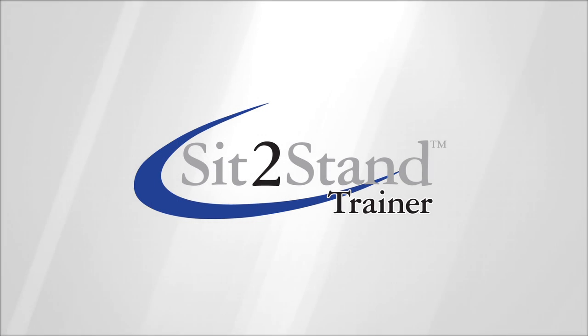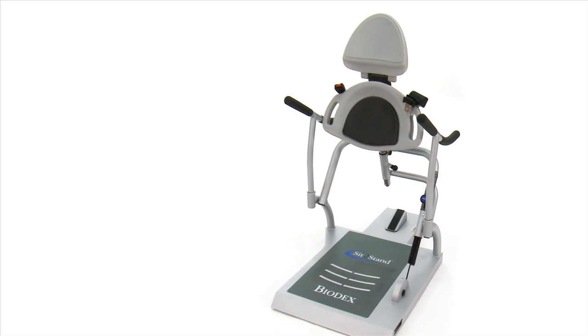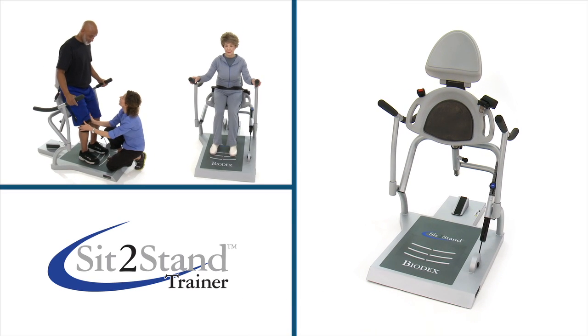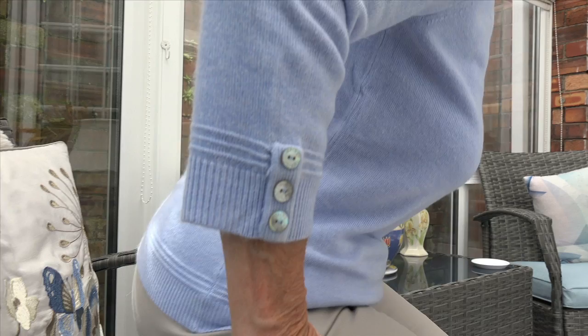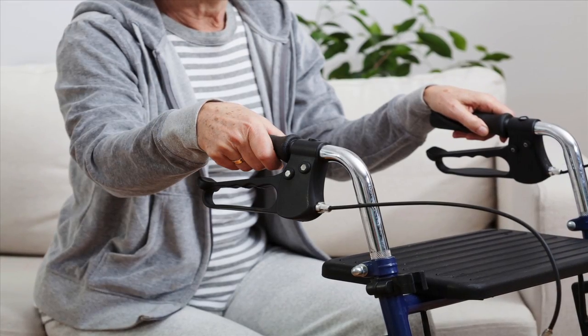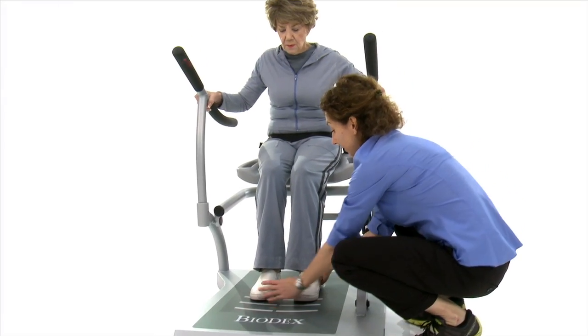The Biodex sit-to-stand trainer is an exercise device for strengthening the muscles necessary to achieve the sit-to-stand motion, used for physical rehabilitation as well as older adult wellness. The ability to rise from a seated position is the first link of the mobility chain and the first link that starts to suffer with age-related muscle weakness. That's where Biodex can help.